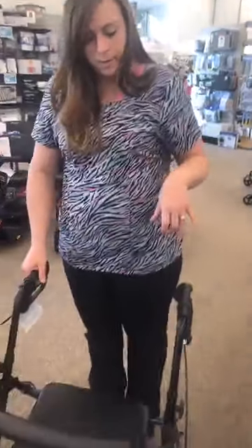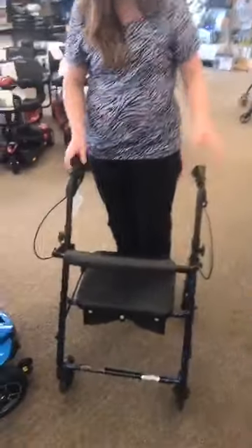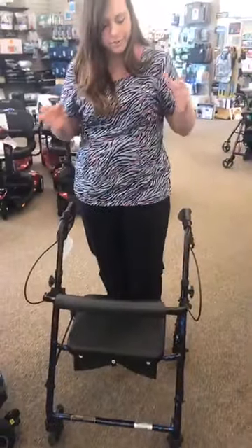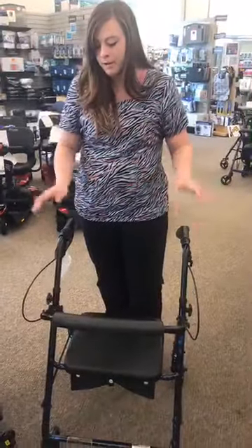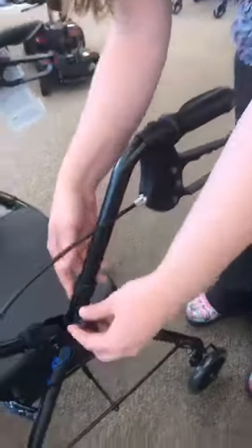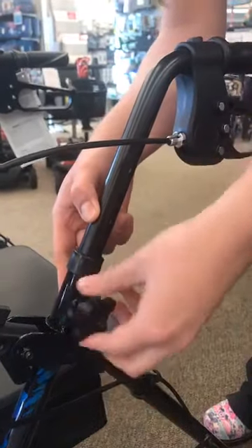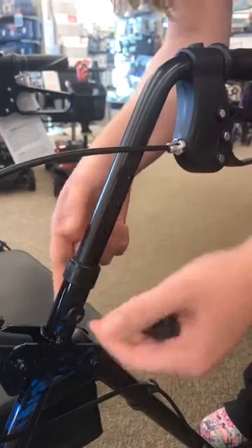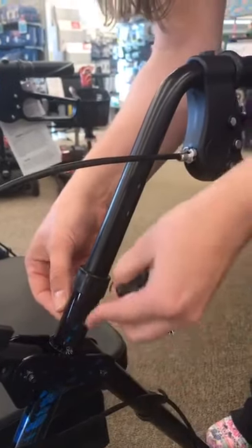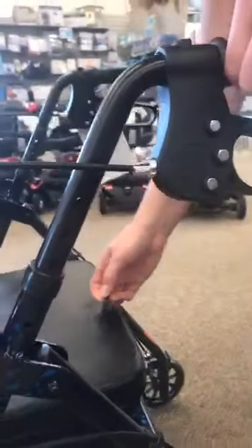So what we're going to do to start with is one of the biggest calls that we have on rollators, which is how do we adjust them. All the rollators, no matter what brand you have, generally have the same adjustments, and they're mainly in your handlebars. Most of them have some type of a screw that you're going to loosen right here. When you loosen this bolt, it actually comes off, and then there's a screw that goes through the shaft. You just take this out, and then they're adjustable up and down, so you can adjust it to the height that you're going to need.